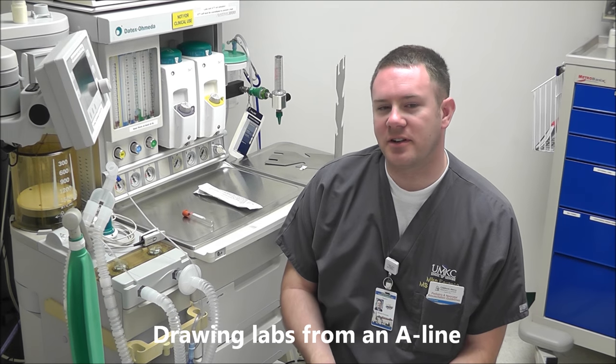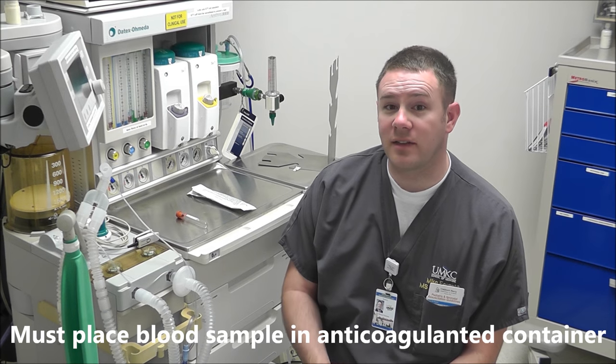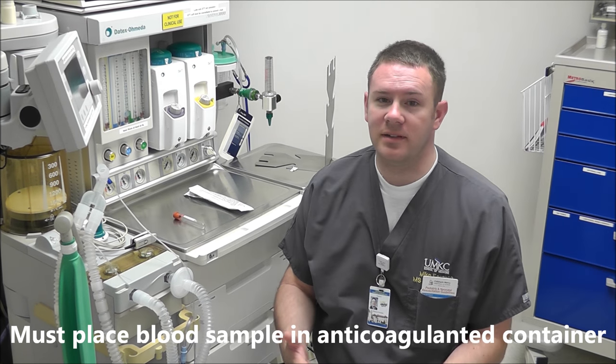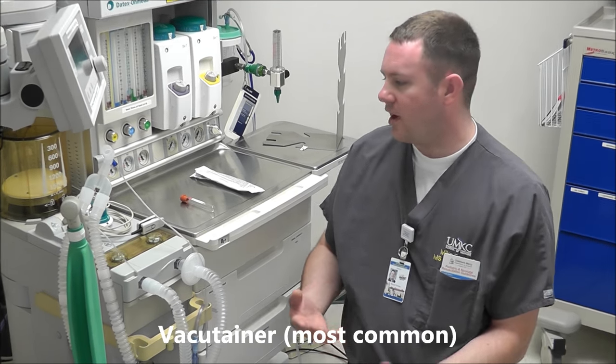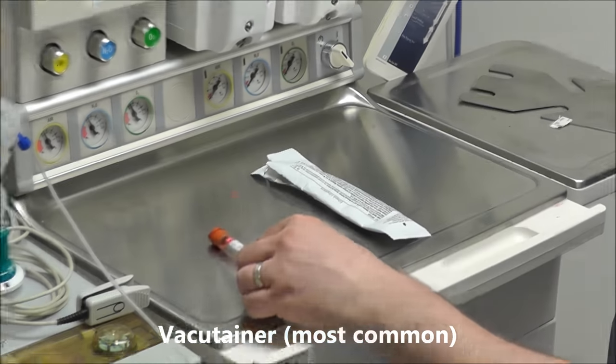Today we're going to talk about drawing labs from an arterial line. The first thing we need to consider is the container that we're going to put our blood sample into. The container must have anticoagulant. The first type is a vacutainer, which is the most common.